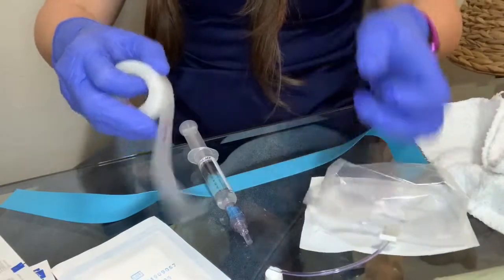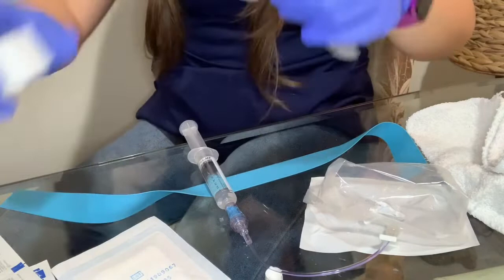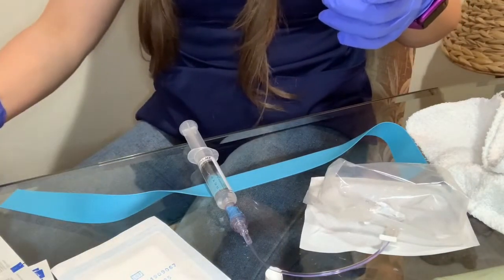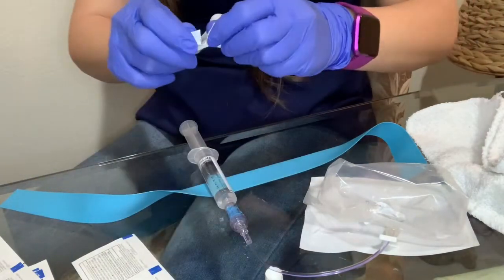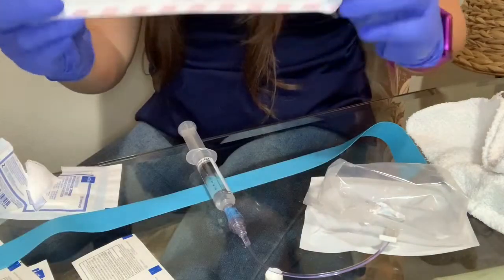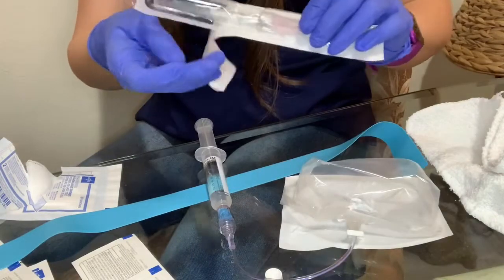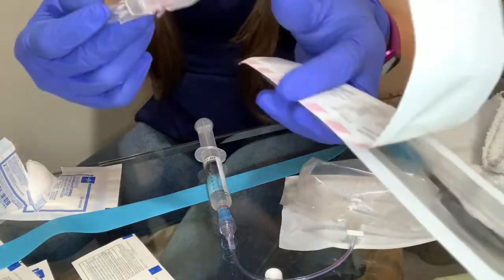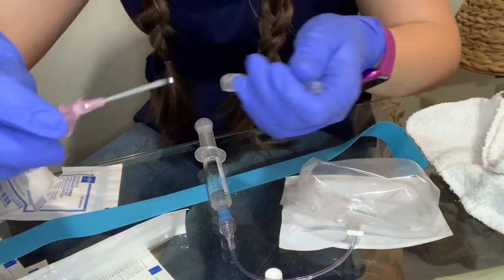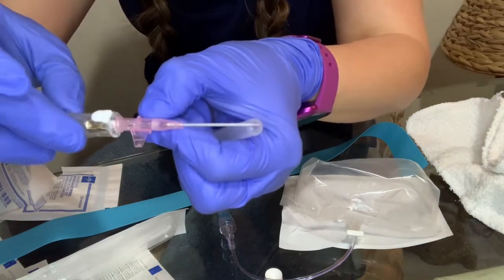The next step is I always take a piece of tape and a gauze and keep them close to me, so in case I miss that vein I have a gauze ready to put pressure. Also, I always try to check that the needle is working properly — I slide it and make sure that it works.